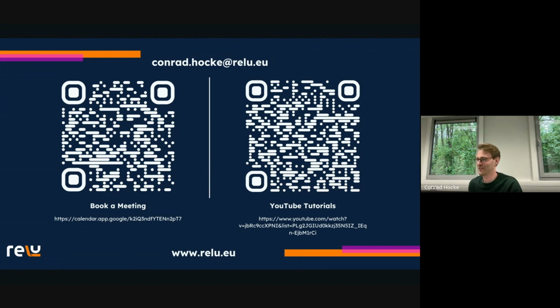Yes, I can answer that question. We are already integrated into other software. So as you've seen, Planmeca Romexis and AutoSelect and Ray already are using our technology inside their software. There's also companies that will be working together with us in the near future, and we will keep you posted about that on our website. So expect more to come there. Those are the only ones as of now, but there are more to come very, very soon.